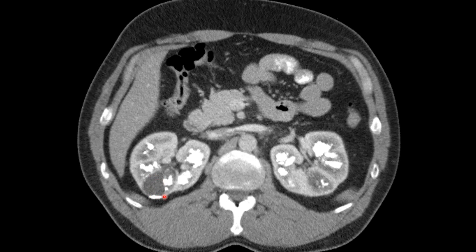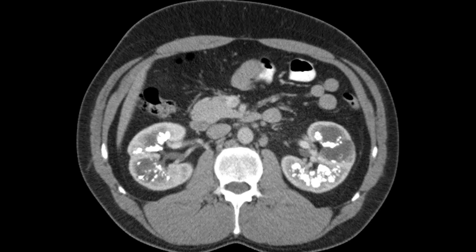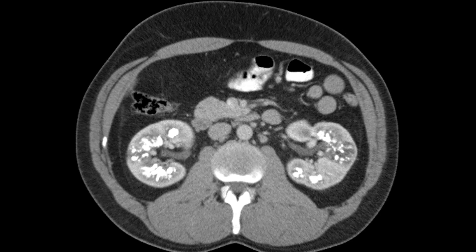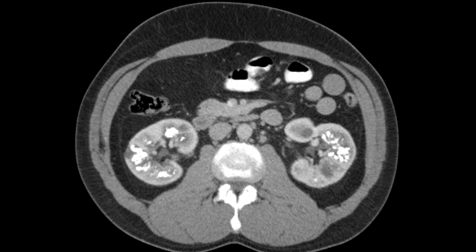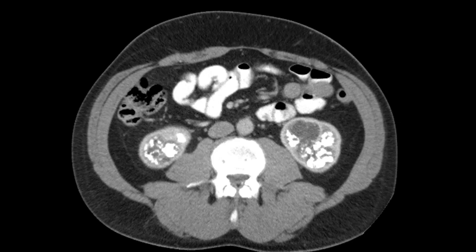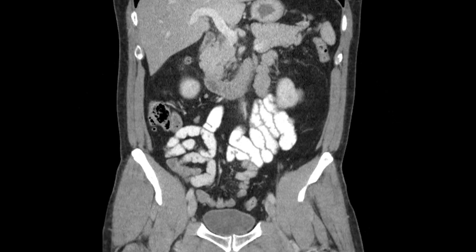There's another cystic area with layering milk of calcium. So we have calcifications with areas of marked renal tubular ectasia. Notice how the renal cortex looks intact — it's really just a disease of the medullary pyramids.